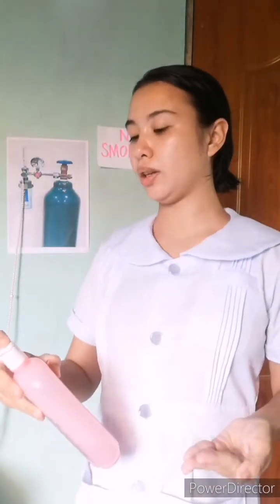Then I'm going to perform hand hygiene to ensure that there are no pathogens or any bacteria that can be transmitted to the patient. Then I'm going to provide client privacy. So in a hospital setting, we have a curtain. So just close the curtain. Or if we do not have a curtain, just close the door and close the window. So the rationale of this is to make your patient feel safer and more comfortable.